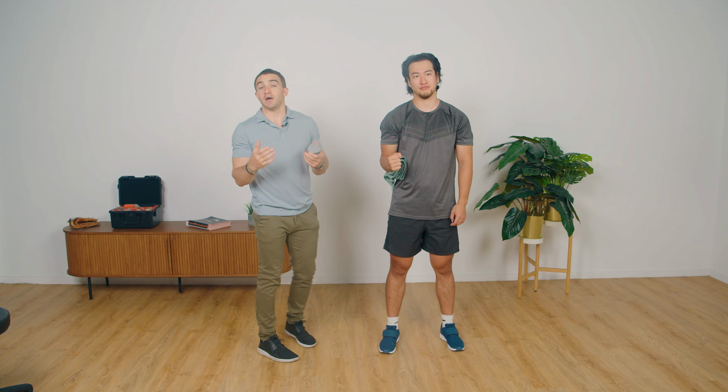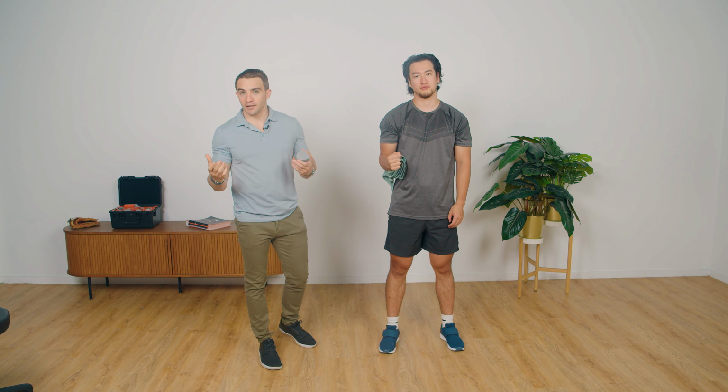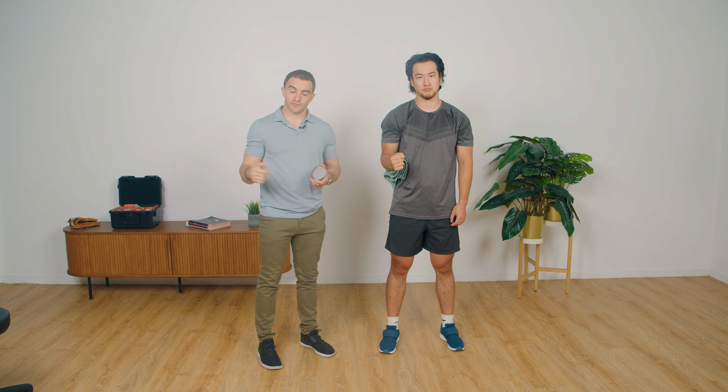Awesome. And if I'm happy that I'm really stable and Cal's applying good force and we're seeing little movement, then I'm getting a good test. If we start to see a lot of movement, then that drops the validity of the test because, again, an isometric test means no movement. If we get movement, I might want to set the test up differently or have Cal strap this back on, push into a fixed surface.